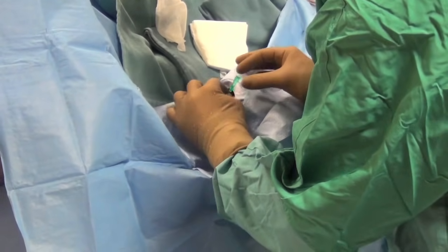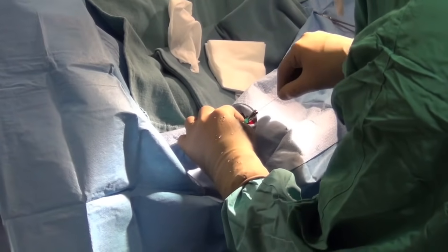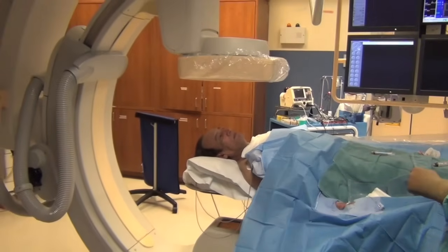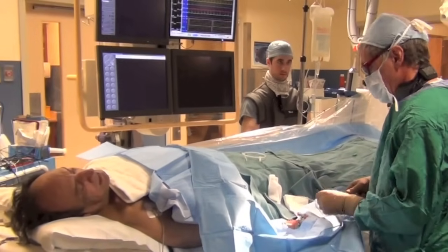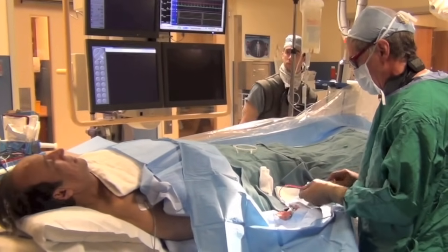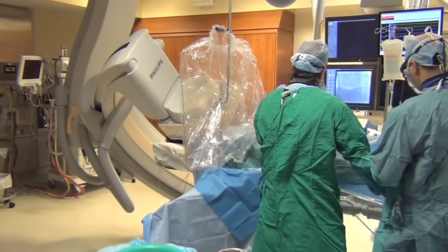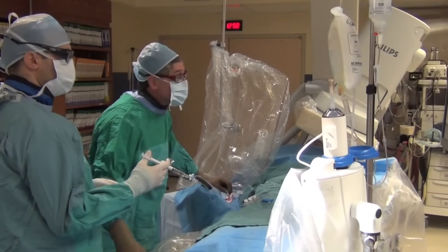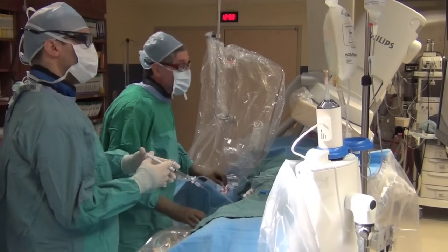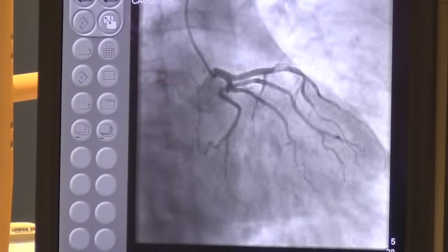We proceed to insert what we call an introducer tube. The introducer tube is in place now. We advance the catheters towards the heart, guided by the x-ray. You can see the people in the room wear x-ray protection in the form of a lead apron, and there are x-ray shields — this is mainly to protect the staff who are exposed to x-rays constantly in their job. Here you can see we are actually injecting the x-ray dye and taking the pictures, and the images are shown in real time on the monitor.